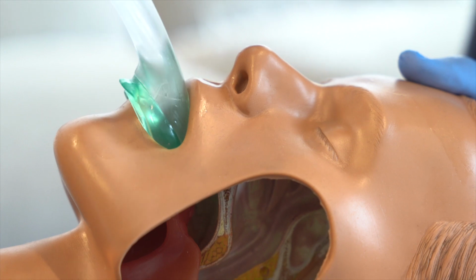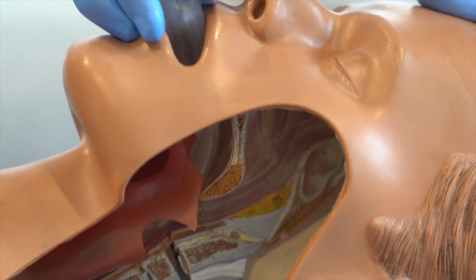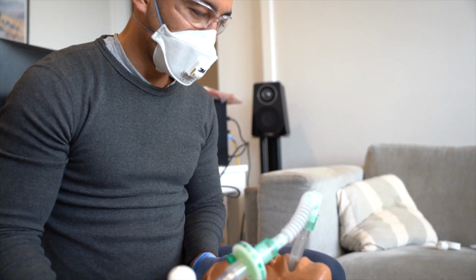Many types of supraglottic airway devices exist. However, in Ambulance Victoria, we currently use the iGel. Once an appropriately sized iGel is lubricated, insert it over the tongue and against the hard palate. Keep advancing until definitive resistance is felt, indicating that the tip of the iGel is seated in the upper esophageal opening. Attach a BVM and attempt ventilation.